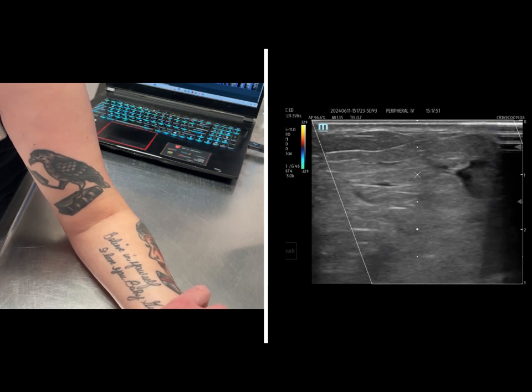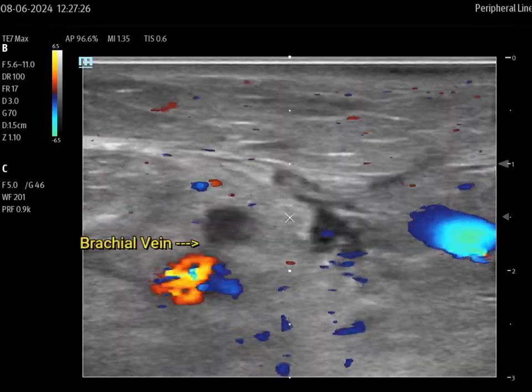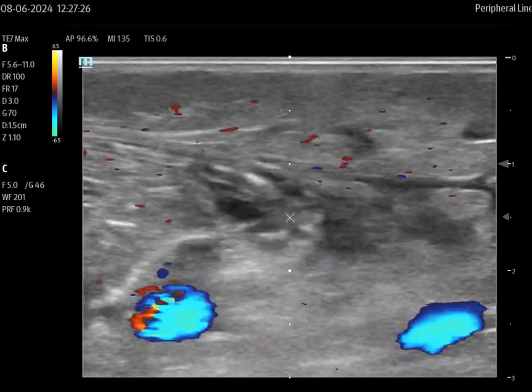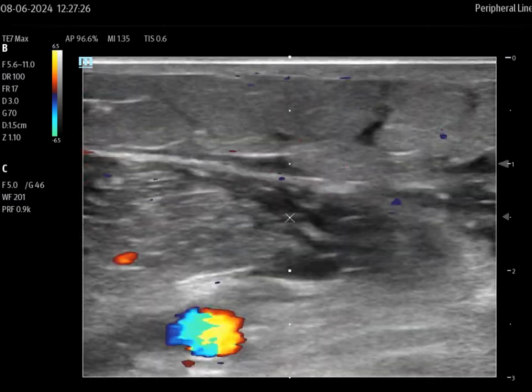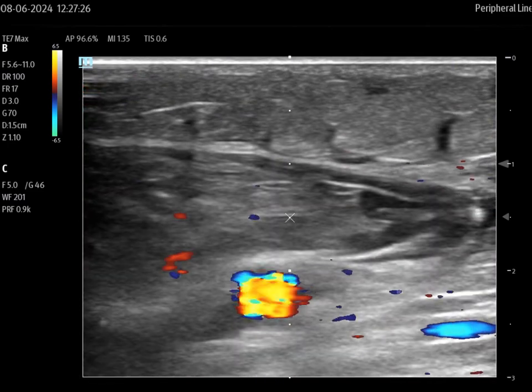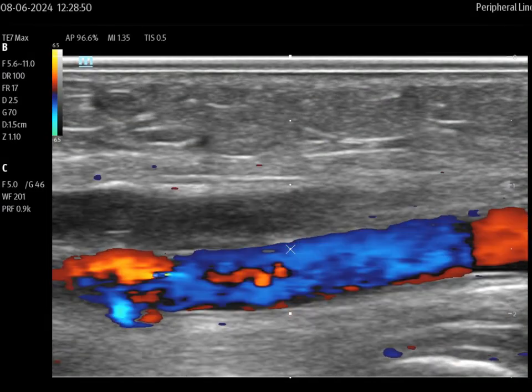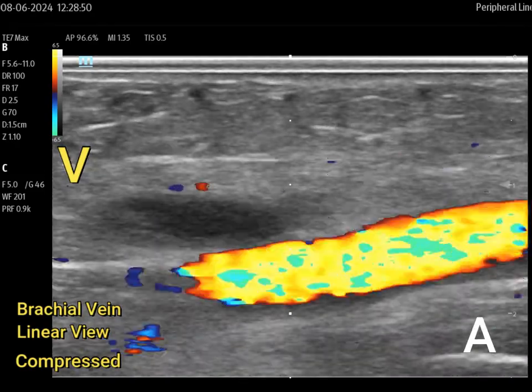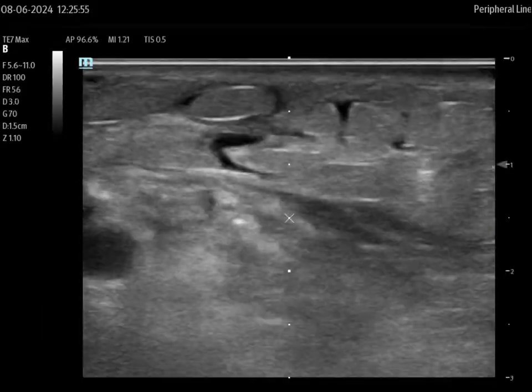Here I'll show you the veins we were looking at earlier using color doppler. You can see the brachial vein — in compressed view you'll see the basilic off to the right and the artery to the lower left. Right away we can already tell there's a problem: it's not compressible, and there is just no flow inside that vein. I'll then activate pulse wave to see if I can hear anything audibly and see any waveforms. Finally, I'll orient the probe in linear view — we have the artery on the bottom, the brachial vein on top. That is the DVT, that thrombosed brachial vein, and we see there is no color flow in there.